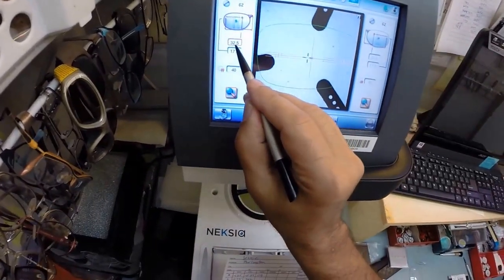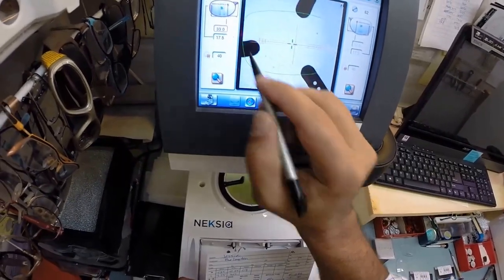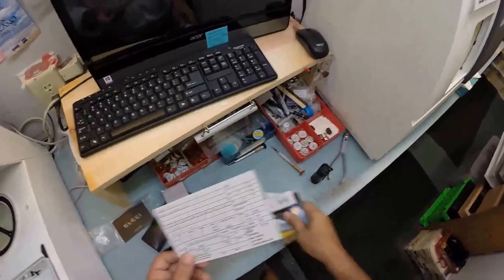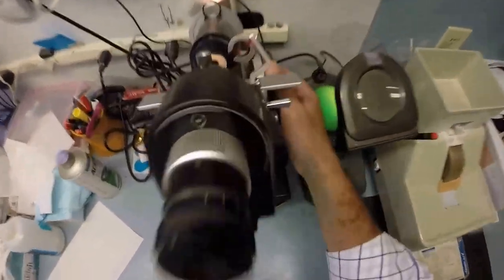Let's go ahead and type in your pupillary distance, which is 66, so that means 33 for both eyes. The computer starts at 32.5, so I don't have far to go to get it to 33. I'm going to hit this plus button and it's going to go up in half millimeters to that.